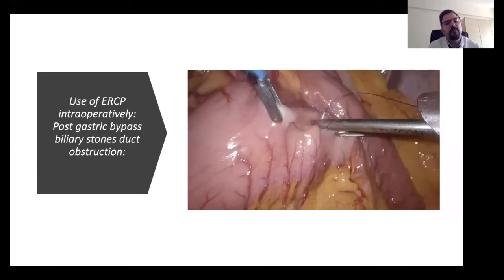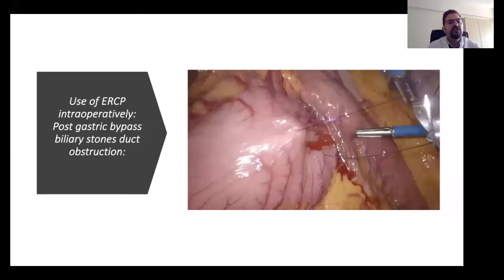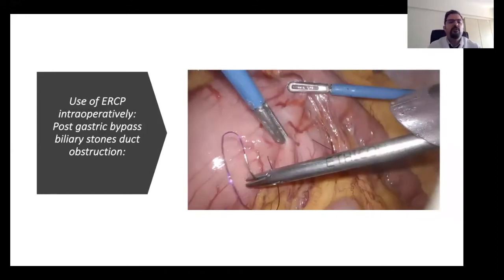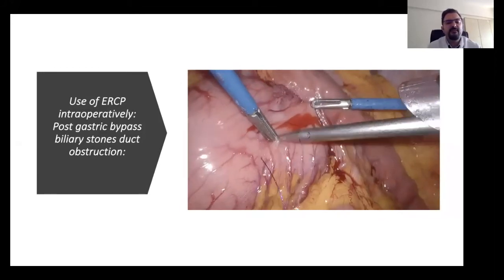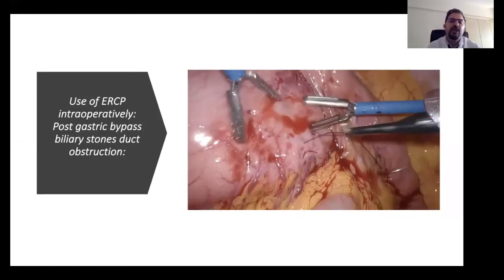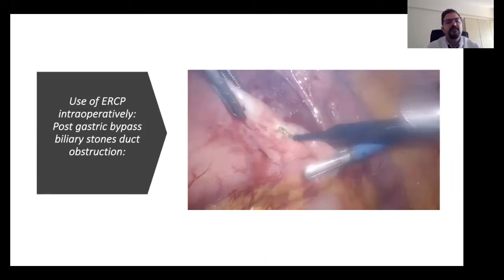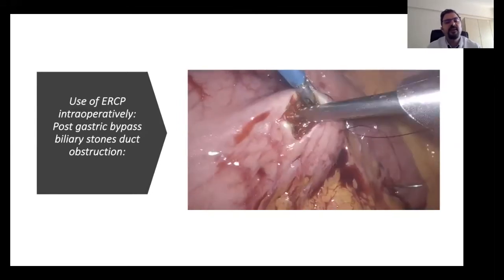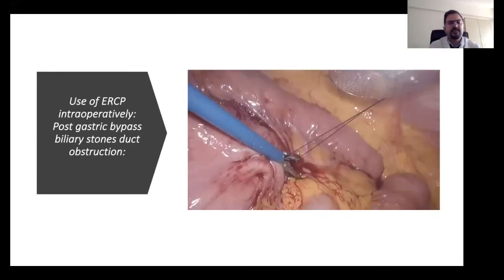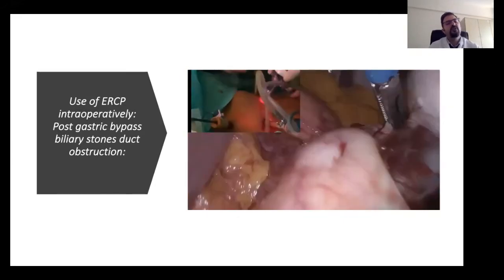With laparoscopy, you can do amazing things. You don't have to open up the patient most of the time because you have the camera, you see it on your side, 20 times bigger than normal. So you can do most of the operations laparoscopically. In that case, we put a trocar inside the remnant stomach, and then we can reach the duodenum and the papilla, and then sphincterotomy can be done and the bile stones can be taken out that way. So you can do this in these kinds of patients, and also when the patient has a total gastrectomy, because then you won't be able to get into the duodenum by the normal route.